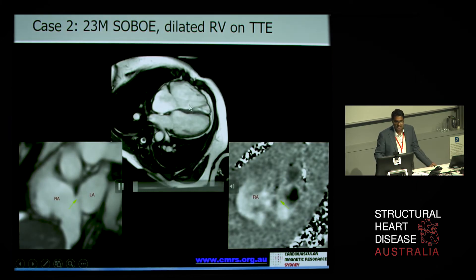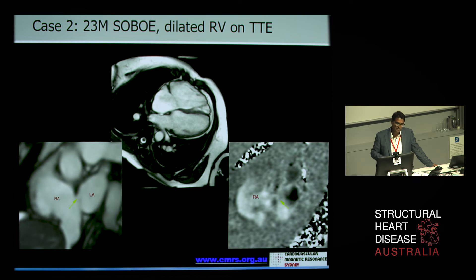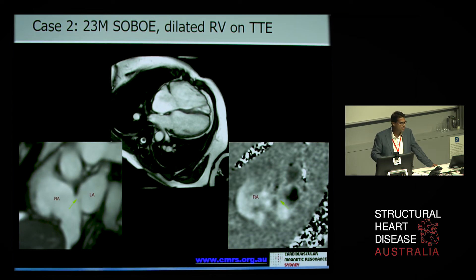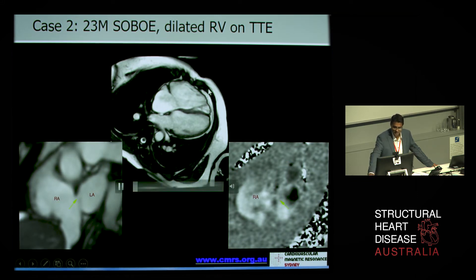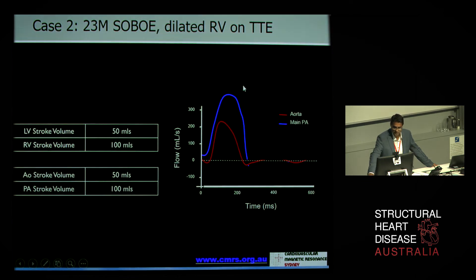Case number two: a 23-year-old gentleman who presents with breathlessness, unusual breathlessness on exertion. Not a particularly fit guy, but noted to be breathless, and he has a dilated right ventricle on echo. The question is, why is the right ventricle dilated?